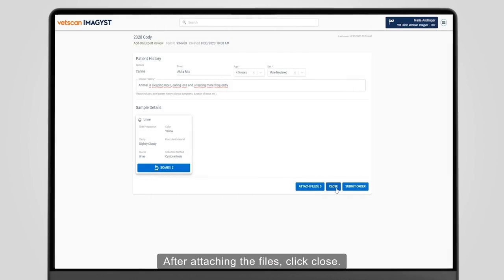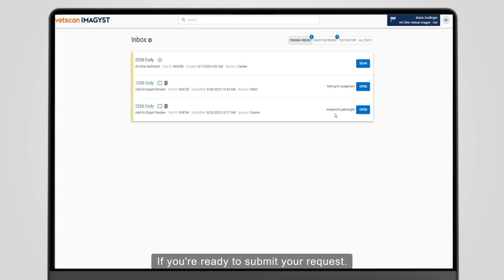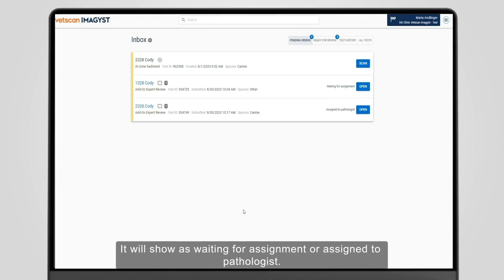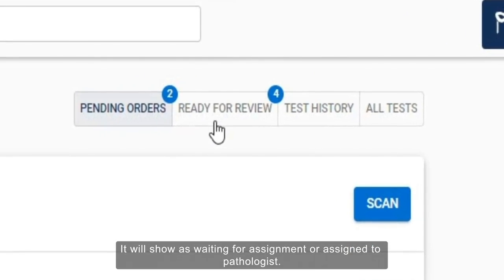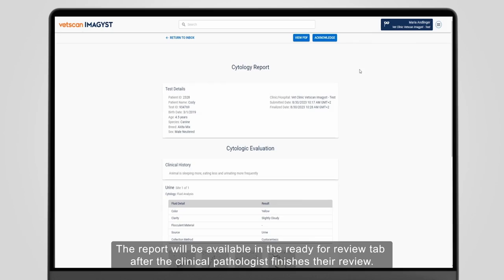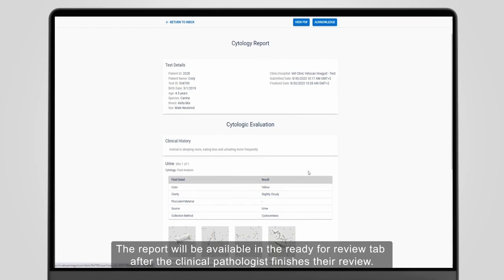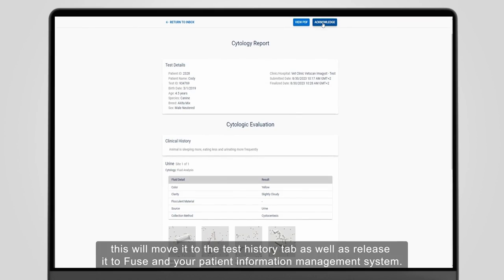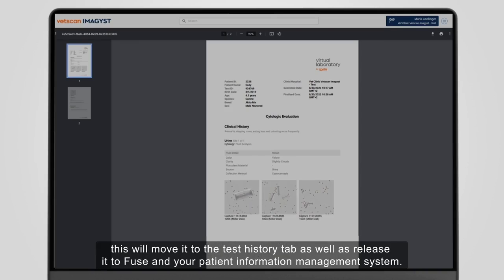After attaching the files, click Close if your request isn't yet complete, or Submit Order if you are ready to submit your request. Your test order will show in the Pending Order tab while it is out for review. It will show as Waiting for Assignment or Assigned to Pathologist. The report will be available in the Ready for Review tab after the clinical pathologist finishes their review. After you review the report, click Acknowledge. This will move it to the Test History tab as well as release it to Fuse and your Patient Information Management System.